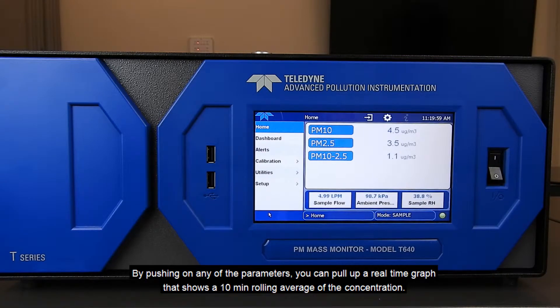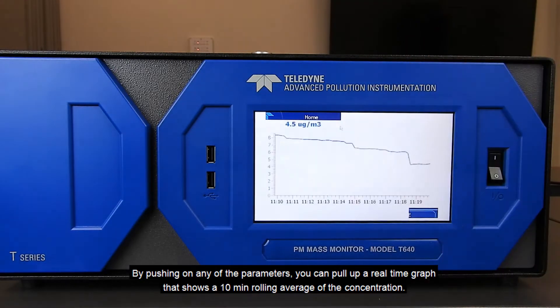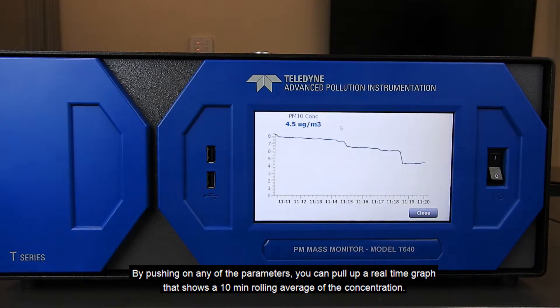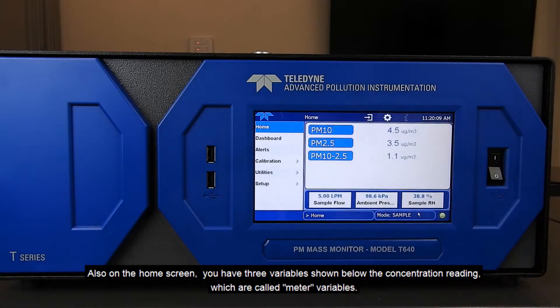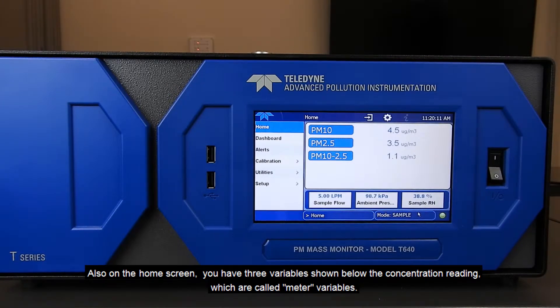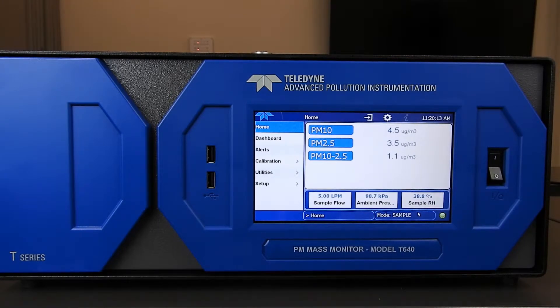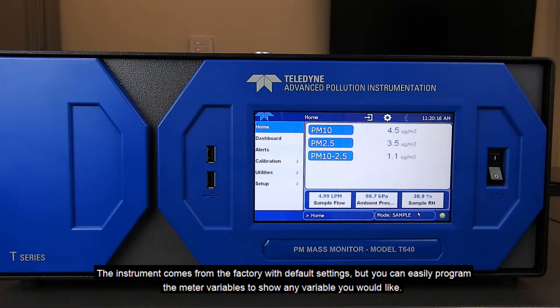By pushing any of the parameters, you can pull up a real-time graph that shows a 10-minute rolling average of the concentration. Also on the home screen, you have three variables shown below the concentration reading, which are called meter variables. The instrument comes from the factory with default settings, but you can easily program the meter variables to show any variable you would like.